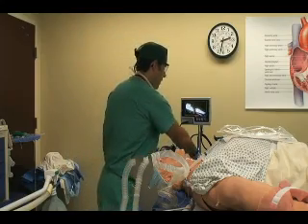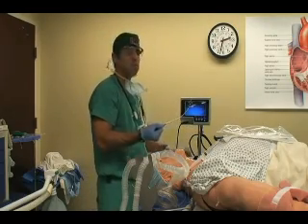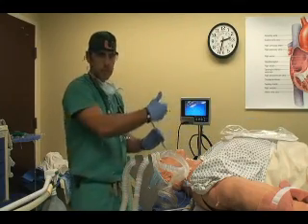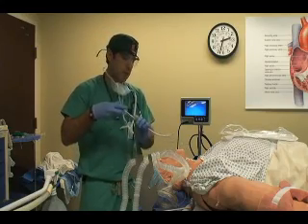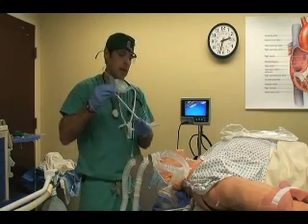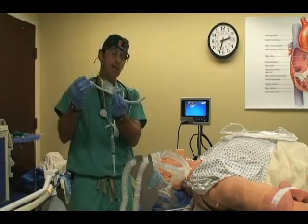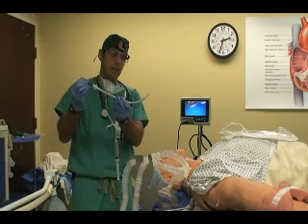Okay. Make sure you have a stylet. The Glidescopes come with a very rigid stylet, and there is a purpose for this. What this allows you to do is, and I will demonstrate inserting an ET tube using a Glidescope, but once you're in view, let's say you need a little more angulation on the ET tube. What you can then do is pull the stylet back some, and you can see how the ET tube just moves ever so slightly.